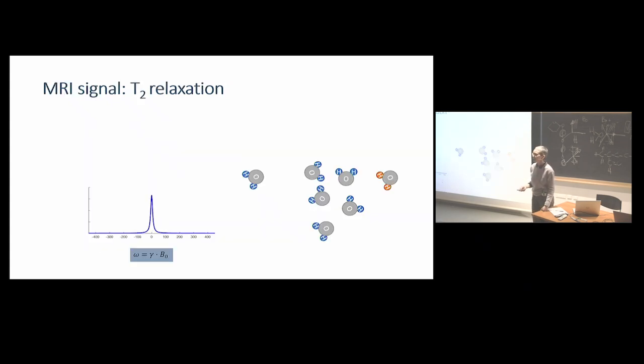Now let's switch from T1 weighted imaging to T2 weighted imaging and quantification of T2 relaxation. To do that, you will see something which you may have seen already yesterday, the magnetic resonance phenomenon, right? We always look at these images and say, oh, this is the MRI. But really what we're looking at is always this resonance. We tend to forget that sometimes.